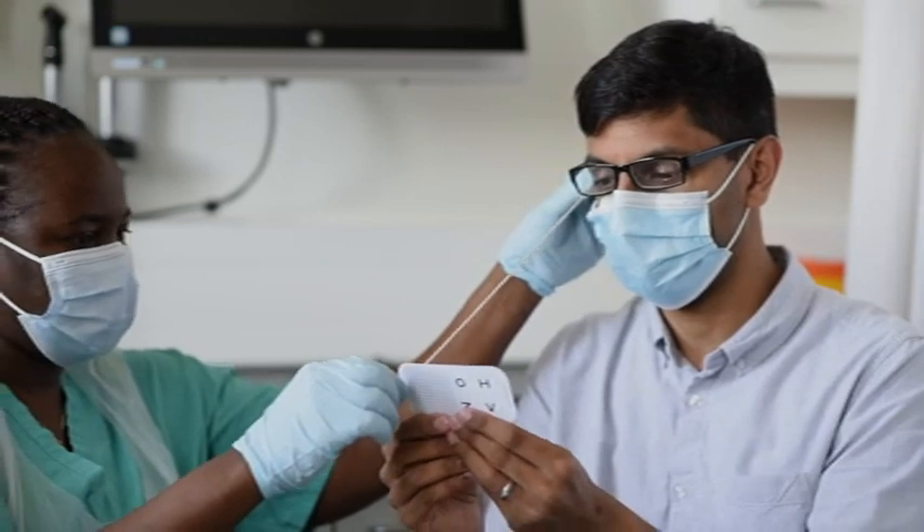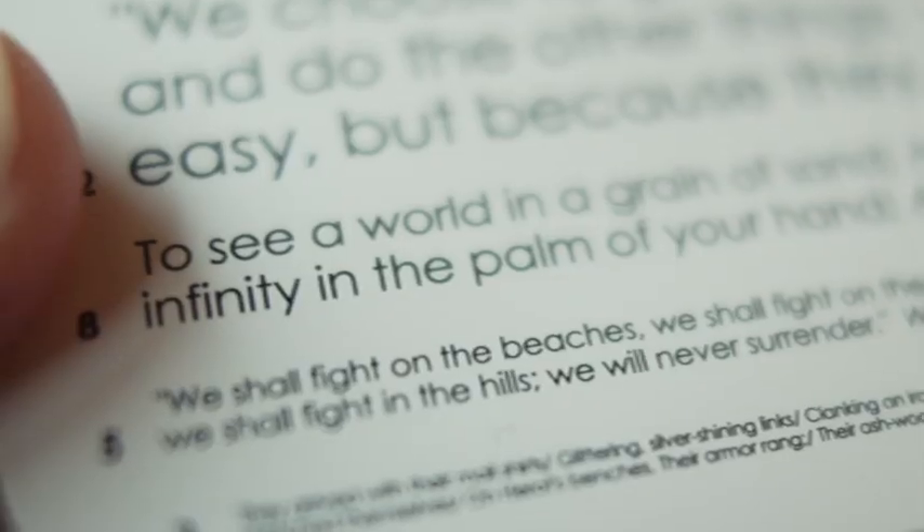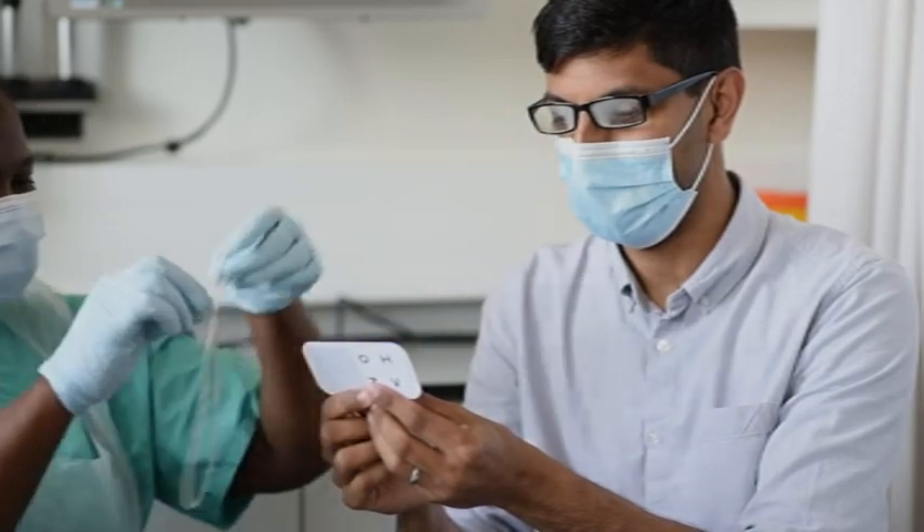If they still cannot read N8 then use the next higher power, and so on until they can comfortably read N8 text. Make sure the glasses fit ok and the patient is happy with their appearance.